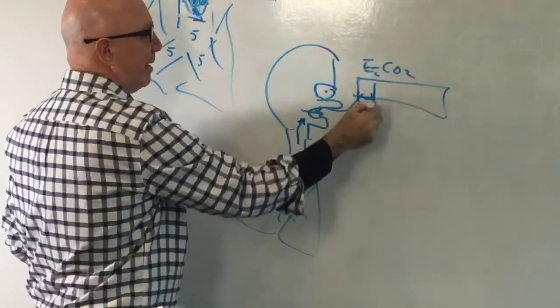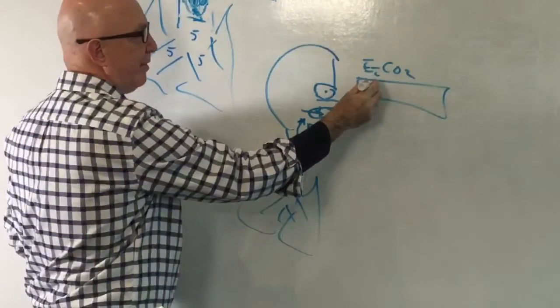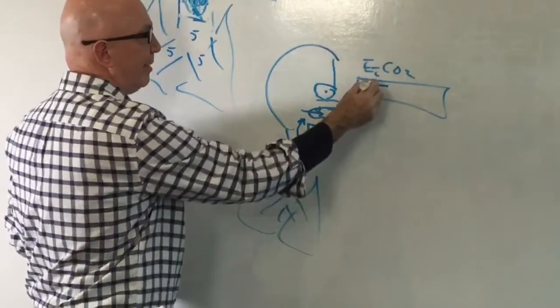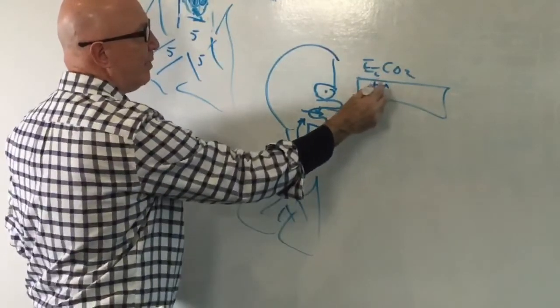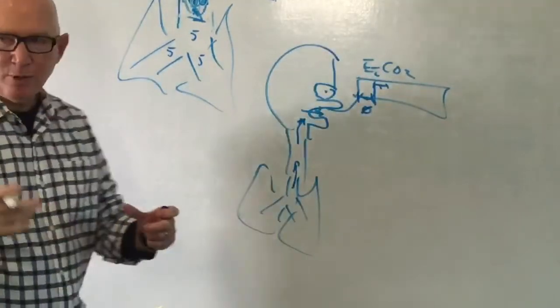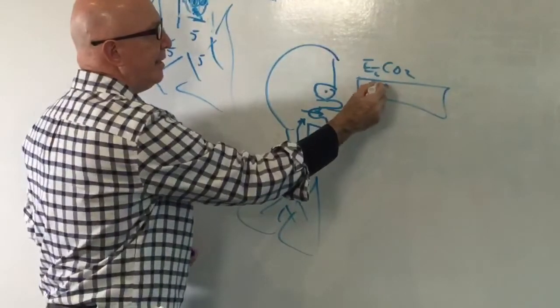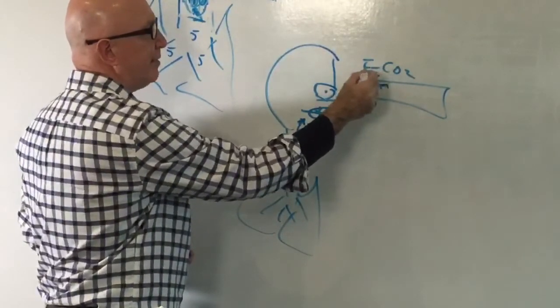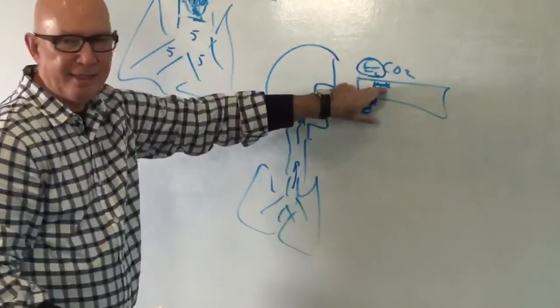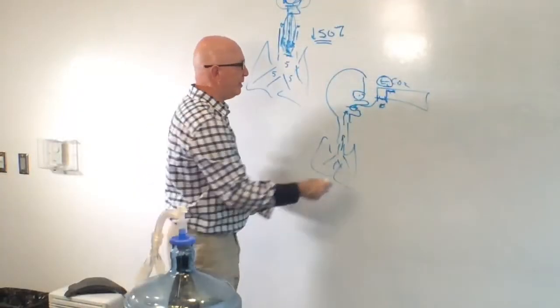Eventually, as exhalation continues, you get alveolar gas coming out of the mouth. So on our end-tidal CO2 waveform, we see the CO2 level rise very quickly and then plateau out for the rest of expiration. When it plateaus out, that means it's only alveolar gas coming out during that plateau phase. Because alveoli empty at different rates, you still may have a bit of an increase during this plateau phase, and that's why it's called end-tidal CO2, because it's the highest carbon dioxide level seen at the end-tidal breath, which is the end of the waveform here.